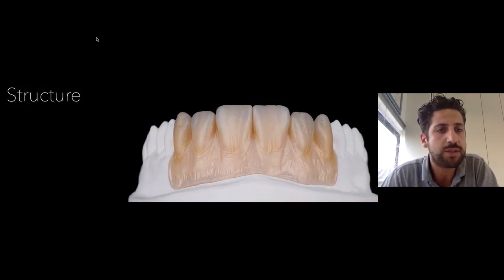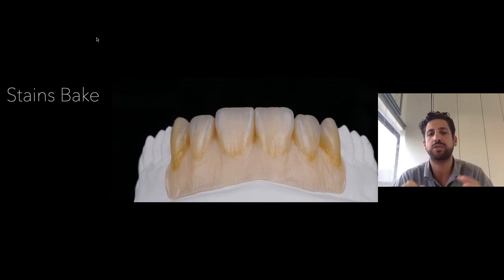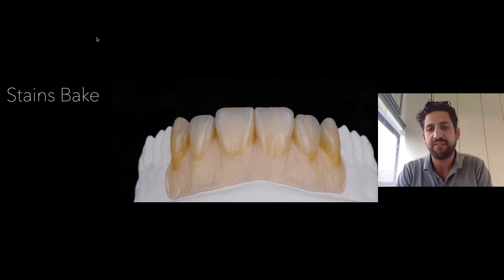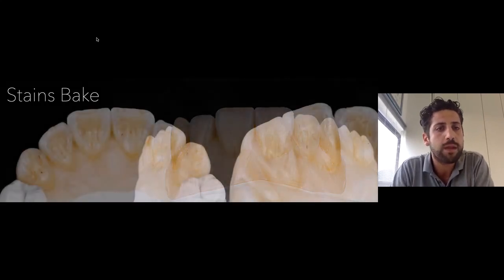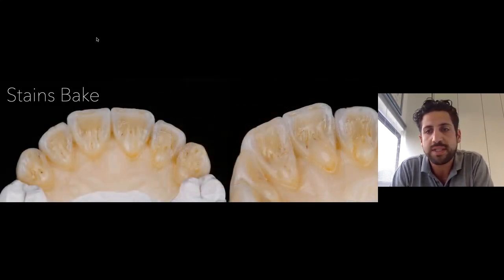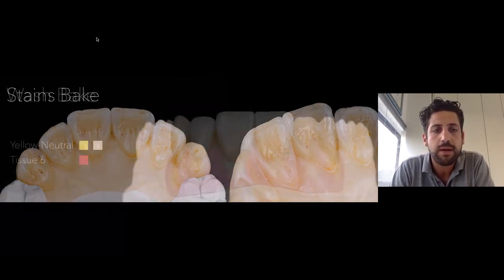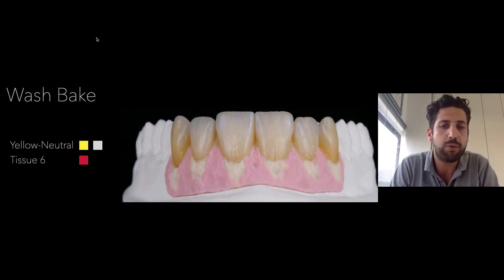So this is our structure. First of all, we start with the stains bake. It's really important to start with the stains because in that way we can already see the final color of our restoration. We do the same for the palatal side. And now we can start with the layering of the vestibular gingiva.